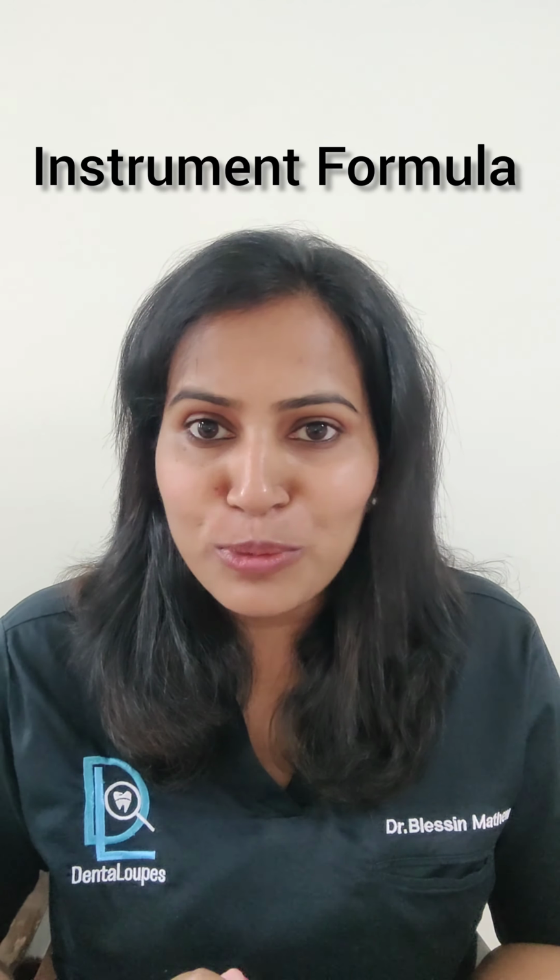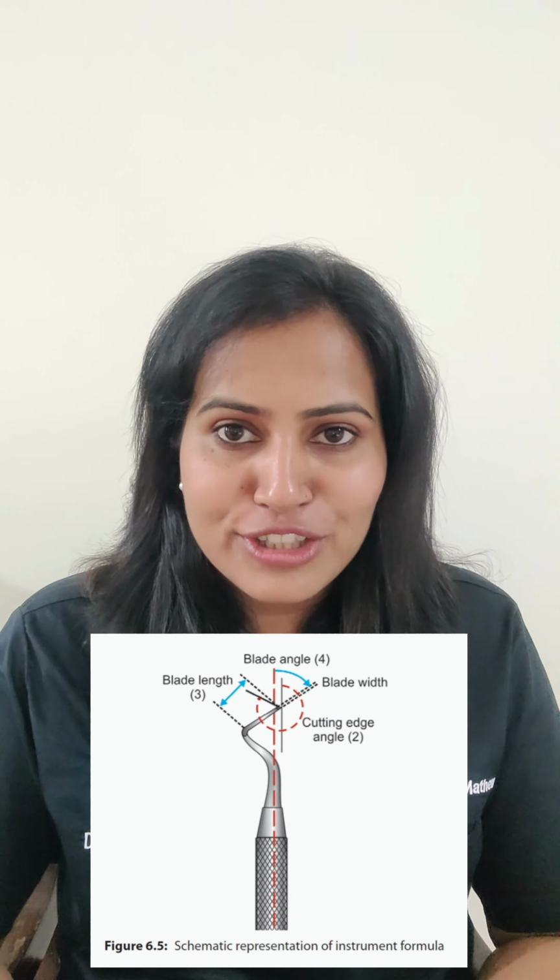What are instrument formulas and what do they represent? It's a code of 3 or 4 numbers printed on the handle of your hand instrument. It's given by G.V. Black to describe the dimensions of your blade and the angles present in the shank. Now it could be either a 3 number formula or a 4 number formula.